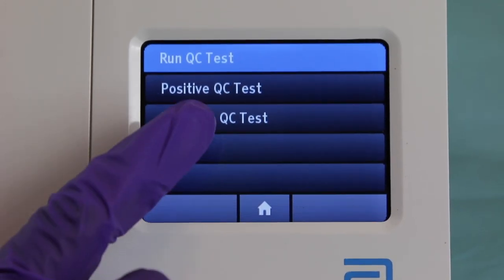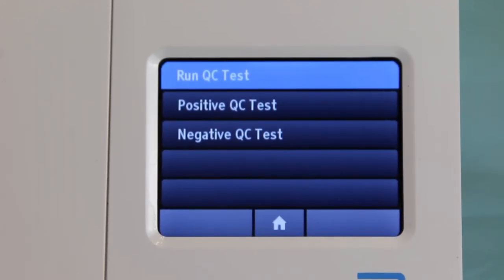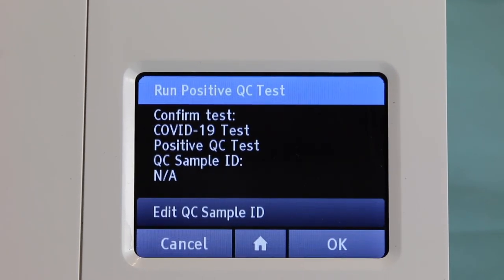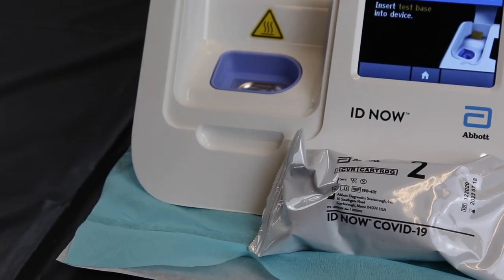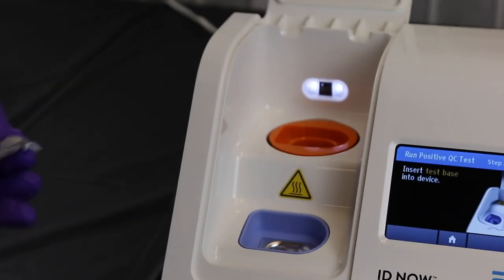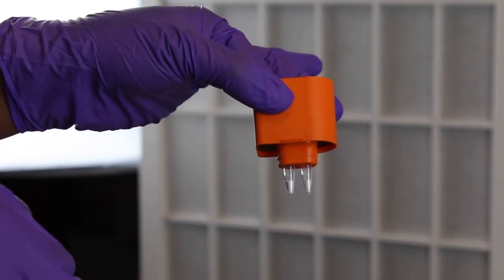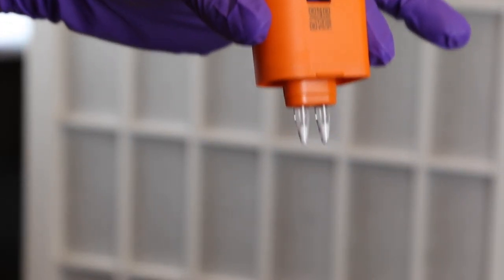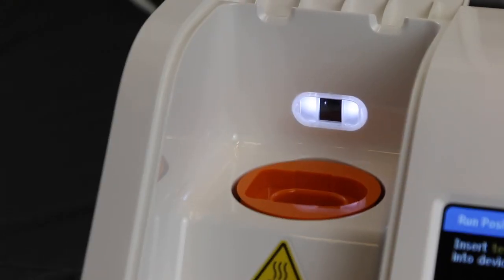Two quality controls must be performed — one for a positive test and one for a negative test. Select 'Run QC Test' and choose either the negative or positive test. Open the package marked with a one; this is your base. Never touch or hold the prongs of the base with your fingers. On the back of the base there is a barcode — when you place it inside the machine, the light reads it, which prevents you from reusing that base more than once.